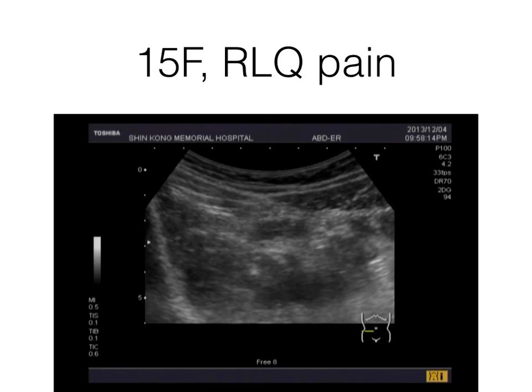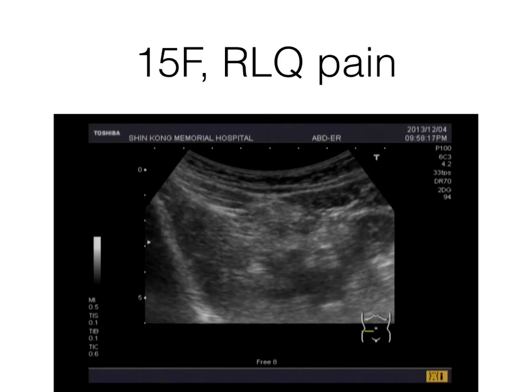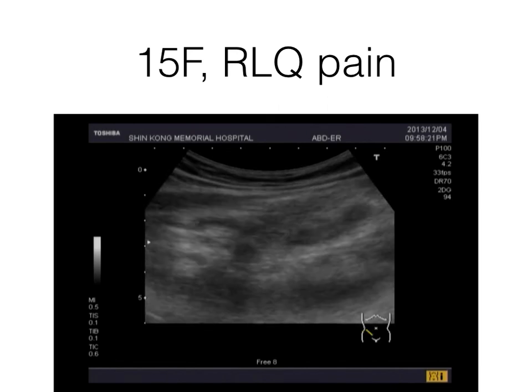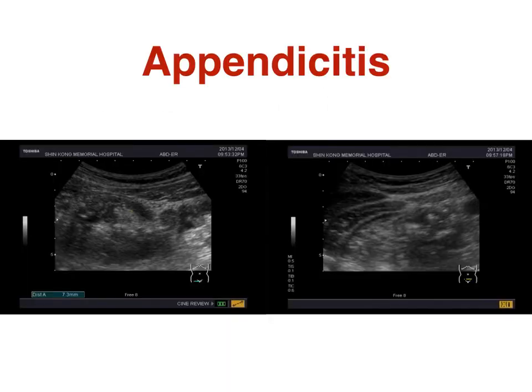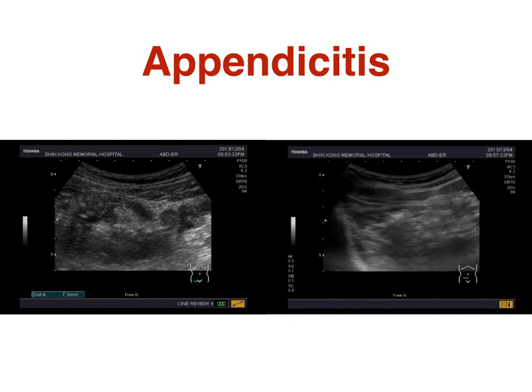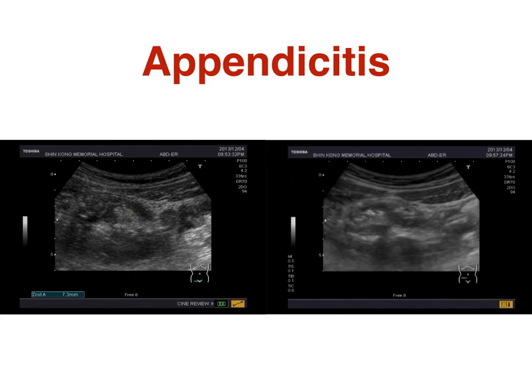Then back. Okay? So every time I scan the appendix, I will scan transversely to see the root and sometimes to see the movement or the rotation. The appendix, see again, transversely, iliopsoas muscle. Here is the tube.